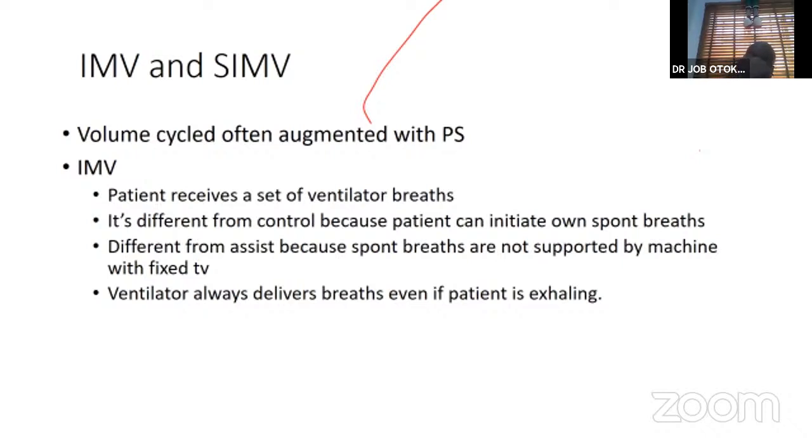If you test it on the ventilator, you will see it. To increase the volume from what you preset, say 500 mLs, when the patient is making 200, you add pressure support. Whatever effort the patient makes, you now support it to the next level.